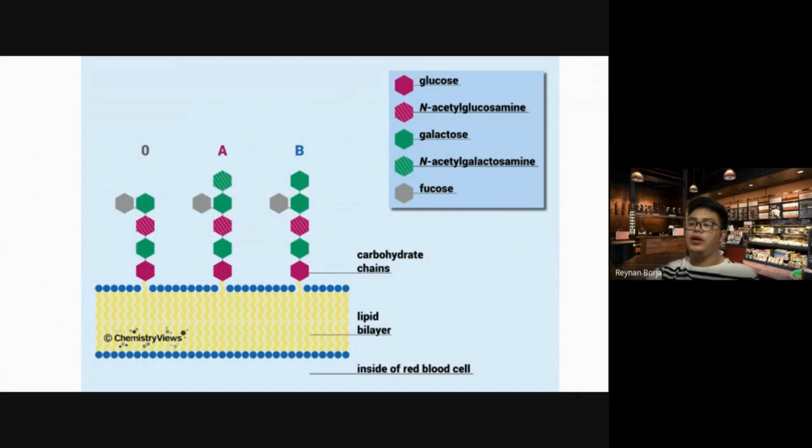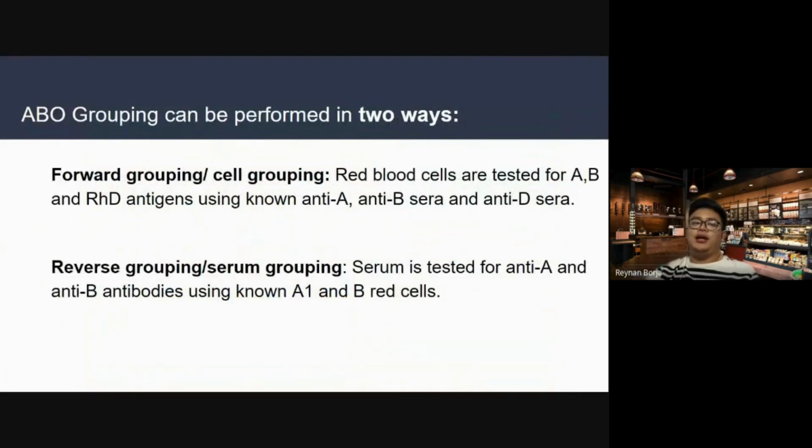Okay? Okay. Next, meron tayong 2 ways para ma-determine yung ating ABO groups. ABO groups, ha?